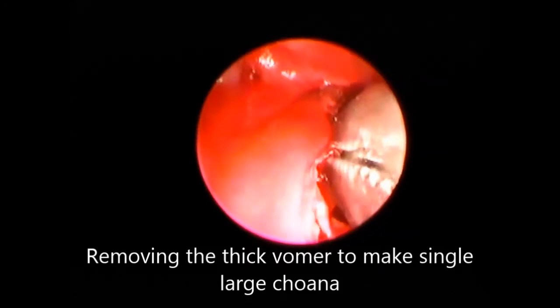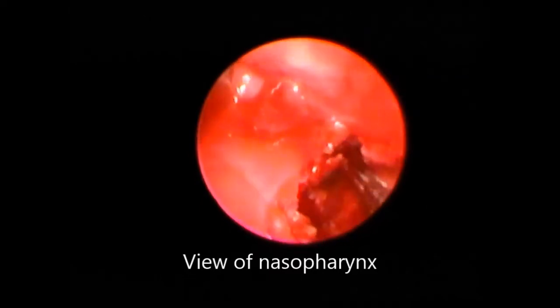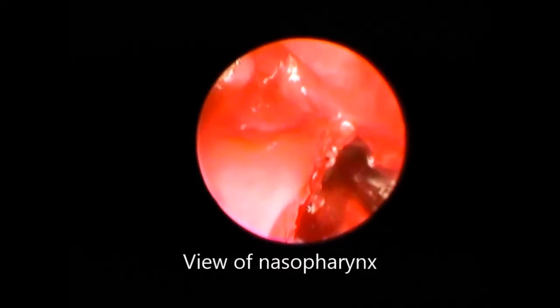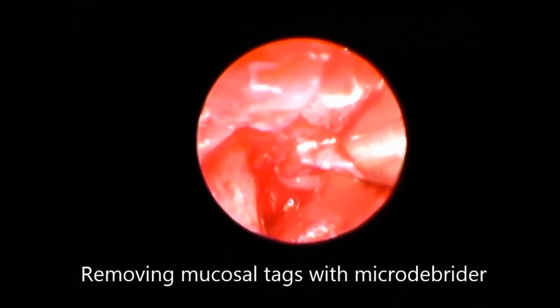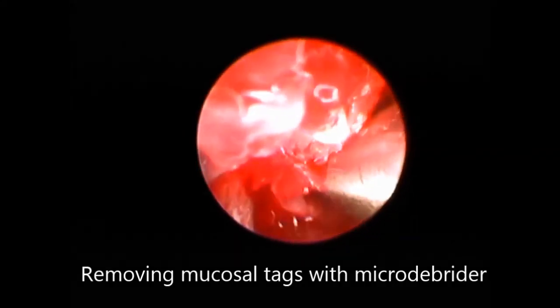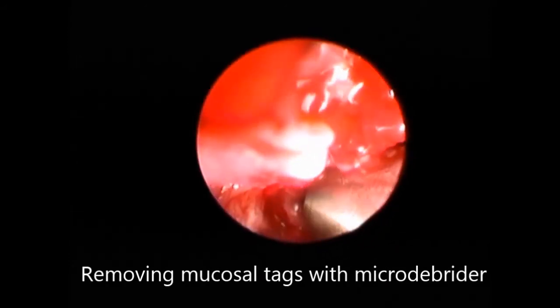Removing the thick vomer — one-third of it is being removed. Backbiting forceps come in handy to remove the thick vomer. Removing this part of the bone gives a nice rectangular view into the nasopharynx. The debrider was then used to cut away the ragged mucosal edges.